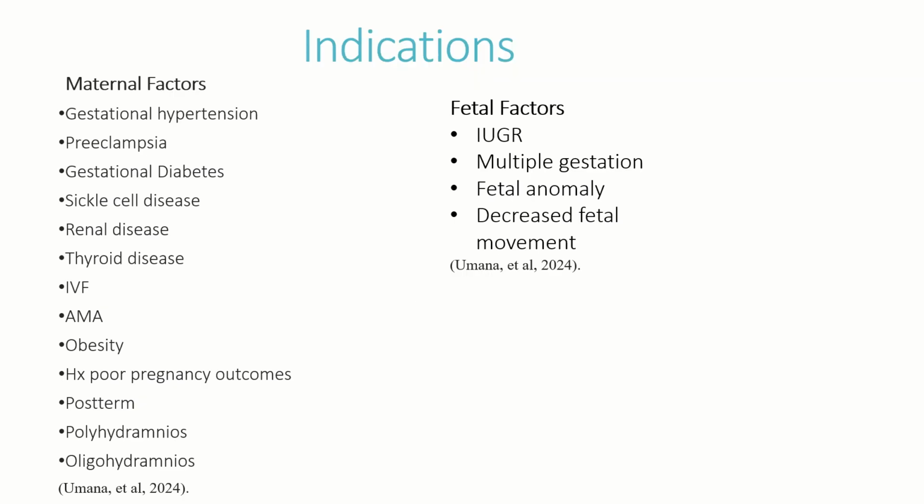The non-stress test is indicated for both maternal factors and fetal factors. Maternal factors include gestational hypertension, preeclampsia, gestational diabetes, sickle cell disease, renal disease, thyroid disease, IVF pregnancy, advanced maternal age, obesity, history of poor pregnancy outcomes, post-term pregnancy, polyhydramnios or oligohydramnios. Fetal factors include intrauterine growth restriction, multiple gestation, fetal anomaly, and decreased fetal movement.